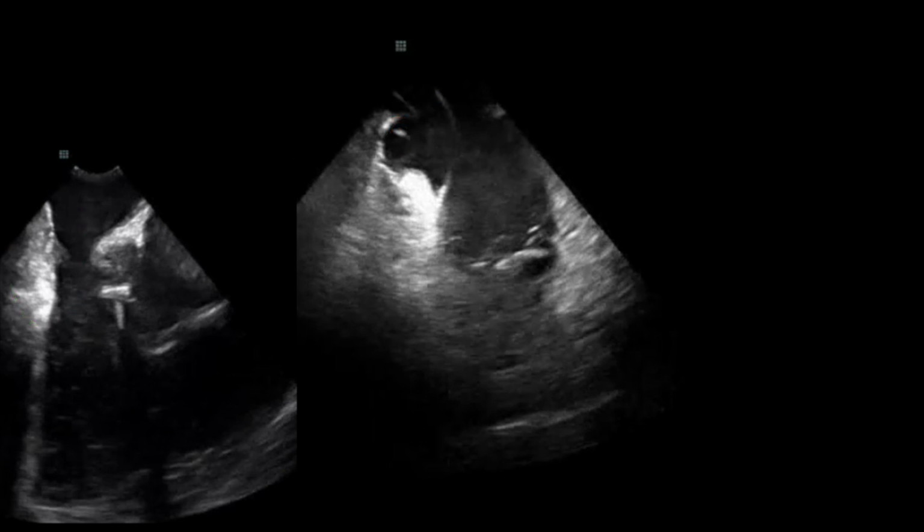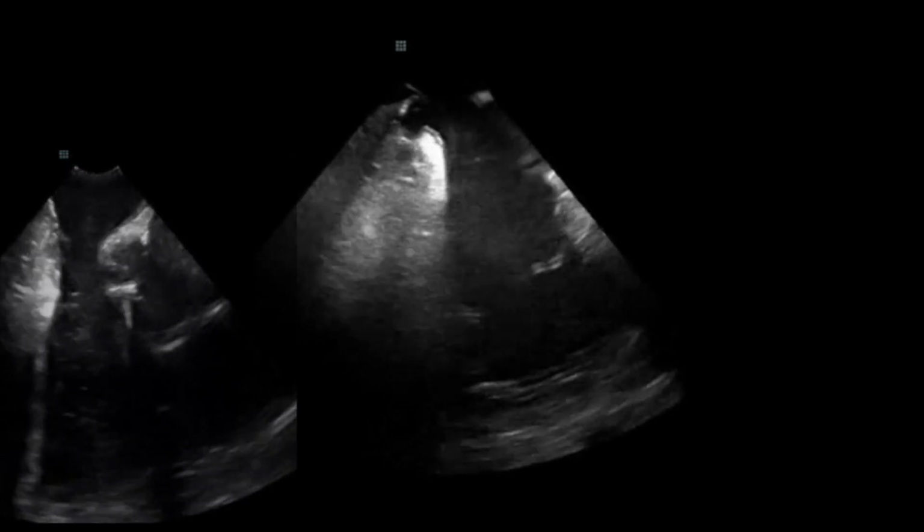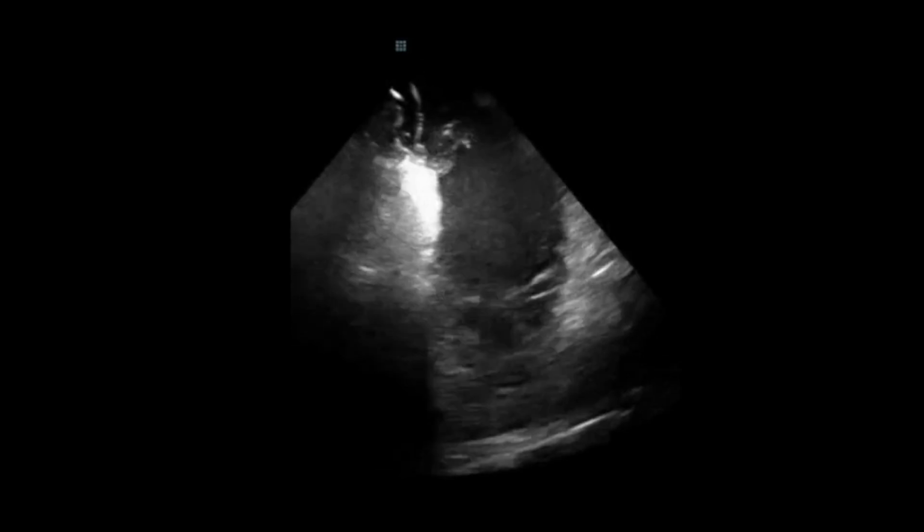If we are able to see that area on the ICE, we can steer our ablation catheter right there and ablate it. Sometimes you can also perform a little bit of counterclockwise rotation of both the ICE and the ablation catheter, and we can ablate a little bit of the lateral part of that pouch, which becomes more shallow and smoother to ablate.